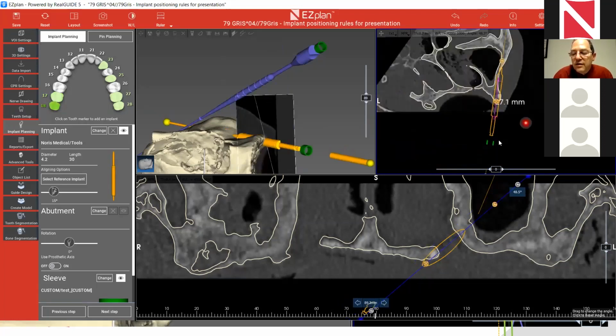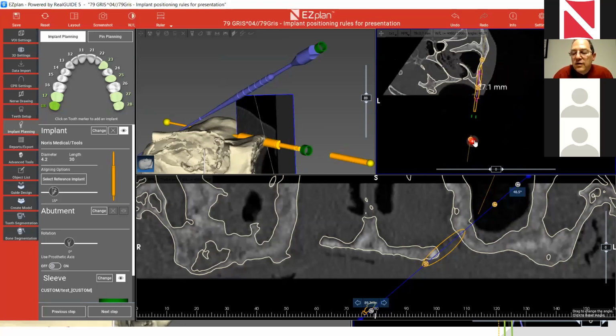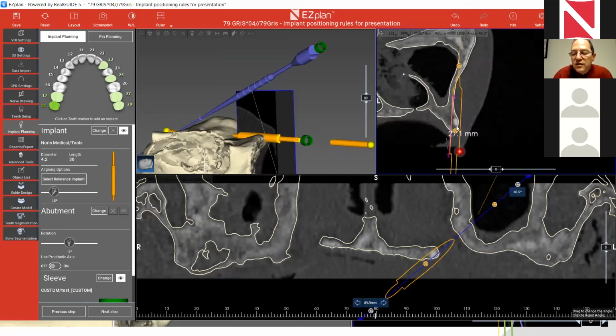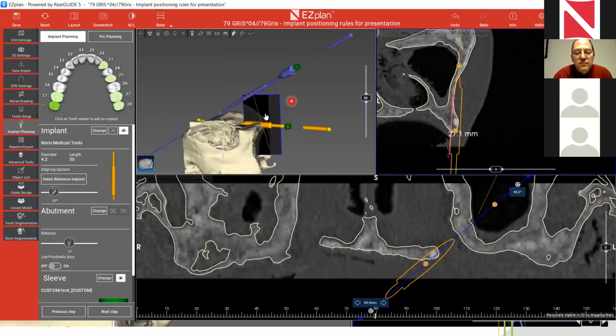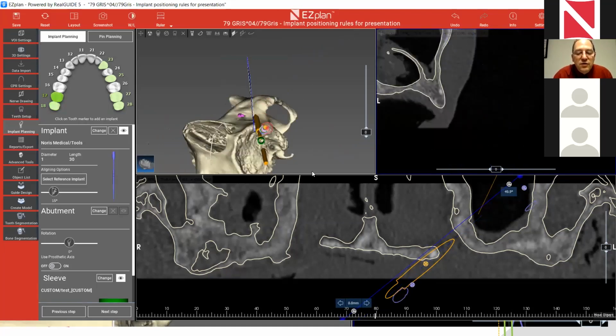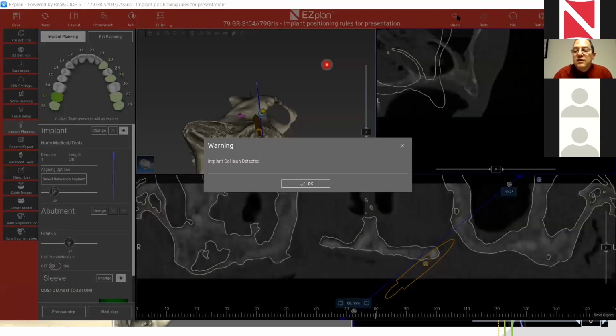Okay, I took it back. This will enable me, and remember that I can do that because over here I already have a groove. I just pulled the drill back and I lean it here. Maybe I don't even make a hole. I lean it here and I take the tool again, like that, and I measure again. Oh, I made a mistake. Just a minute. Mistake.